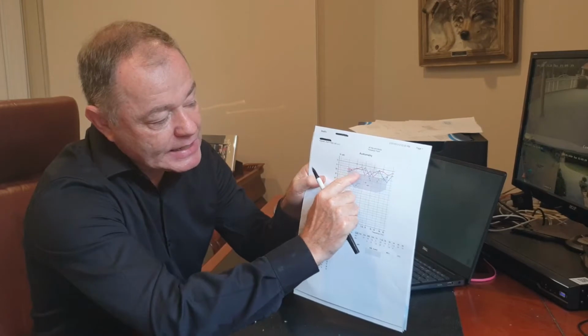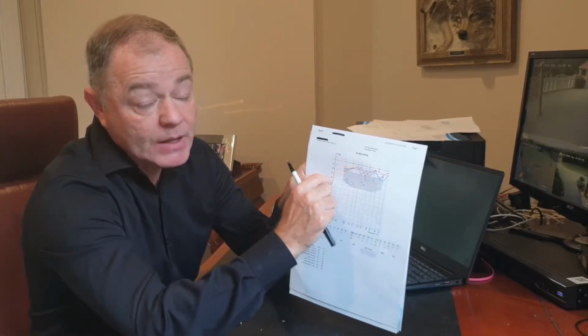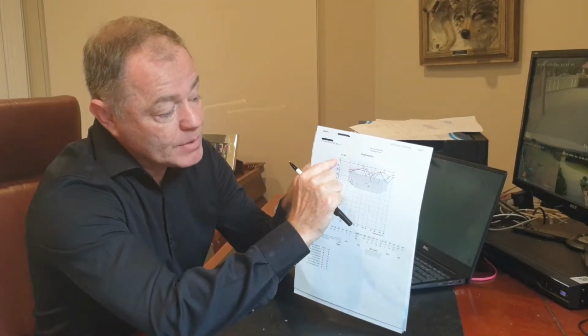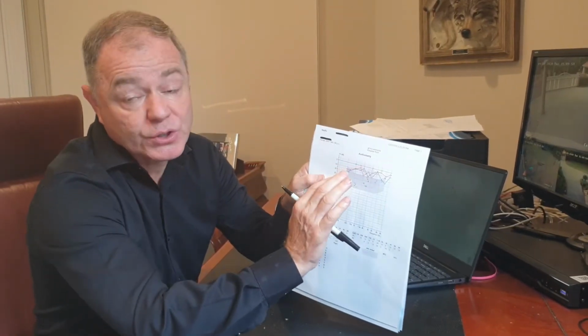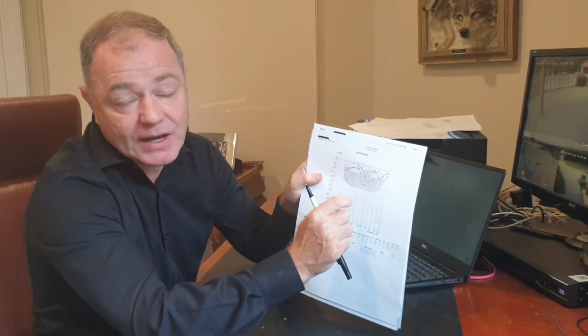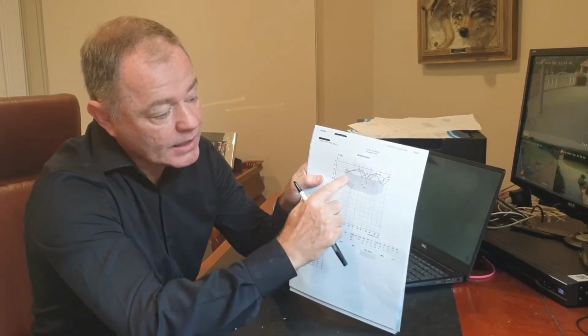If your hearing is above this grey box, in this white area right here, then we would say that your hearing is still within a normal range. It may not be perfect. Perfect is on 0, but if it's within this white area above the grey box, then it's still within a normal range. Once your hearing drops into this grey box, that's when you develop a problem that would normally require some type of attention correction.